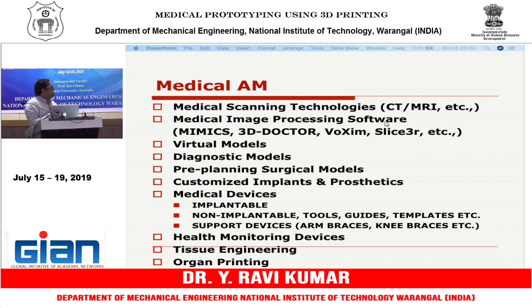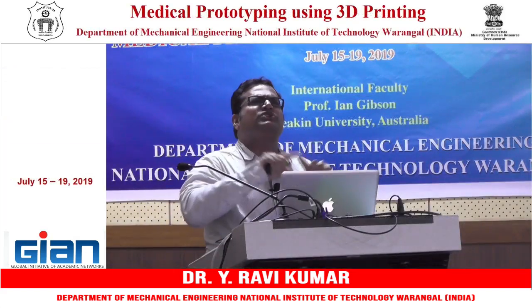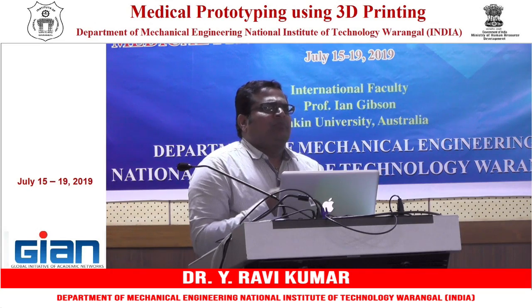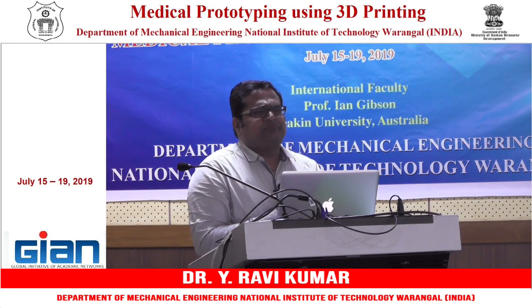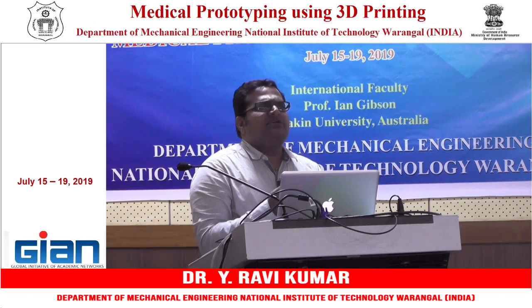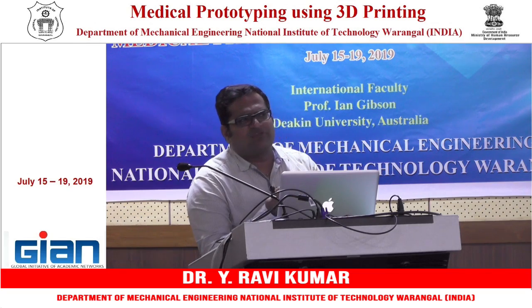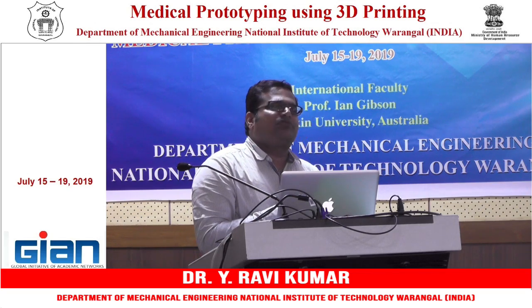images and convert them into a CAD model or a computer model, then the first application is that you want to visualize the anatomy, right? Nothing to do with anything else, but you just want to analyze the anatomy, so you need one computer model. That will give some idea to the radiologist or the surgeon, so they can understand the problem of a particular patient, and what happens, maybe a bone got fractured or some problem in the soft tissues.